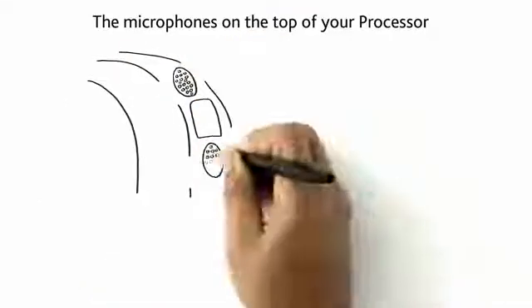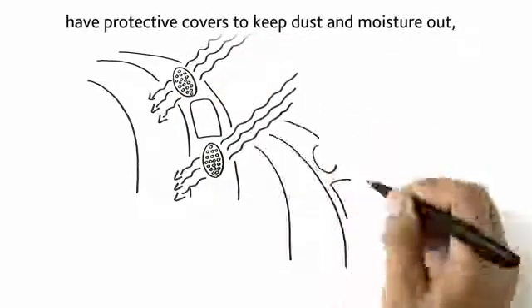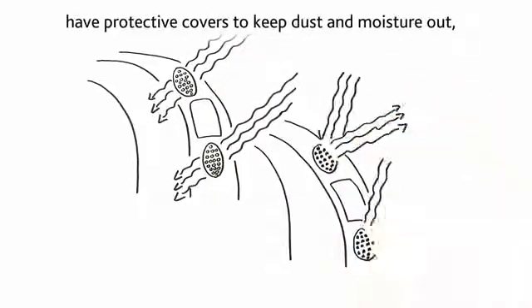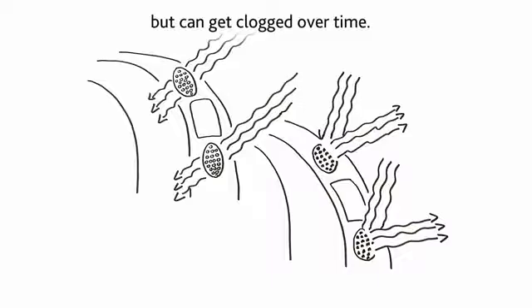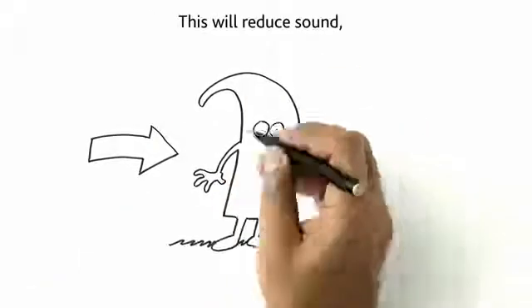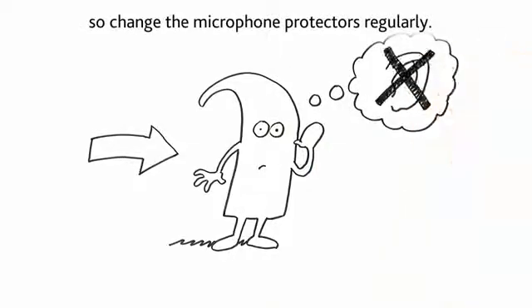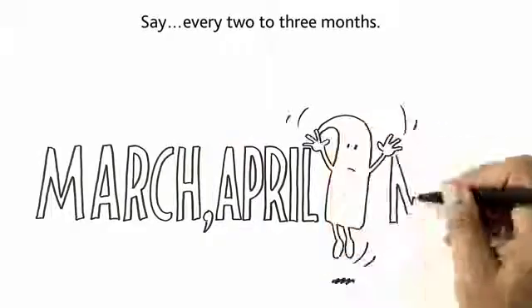The microphones on the top of your processor have protective covers to keep dust and moisture out, but can get clogged over time. This will reduce sound, so change the microphone protectors regularly, say every two to three months.